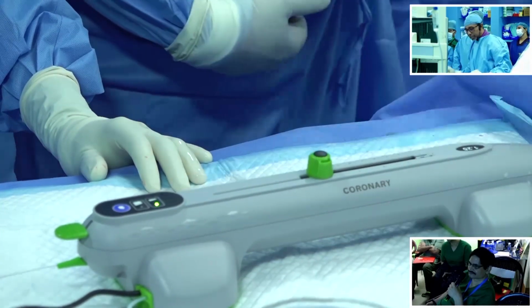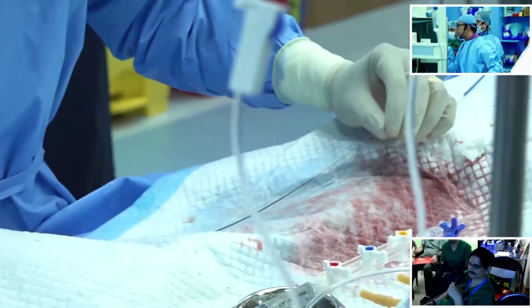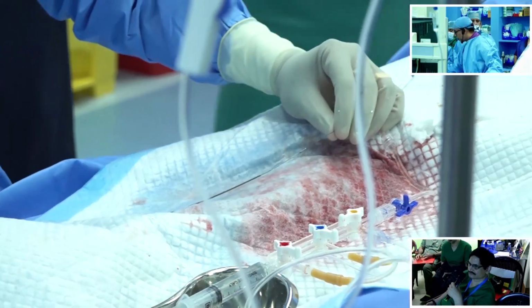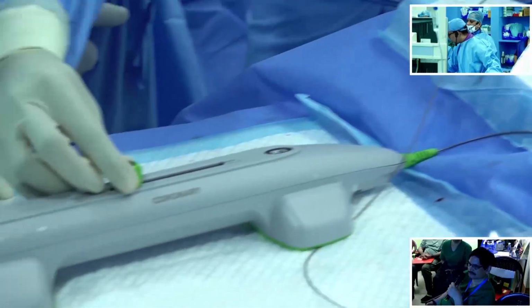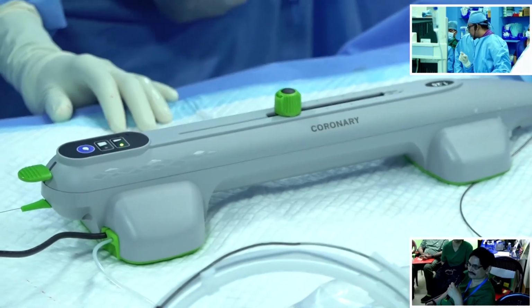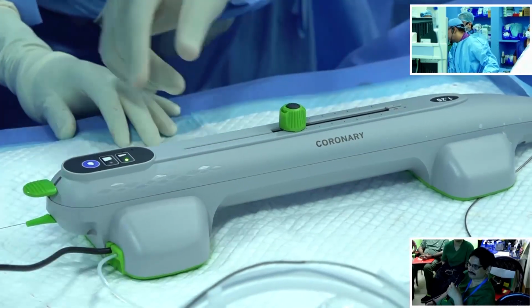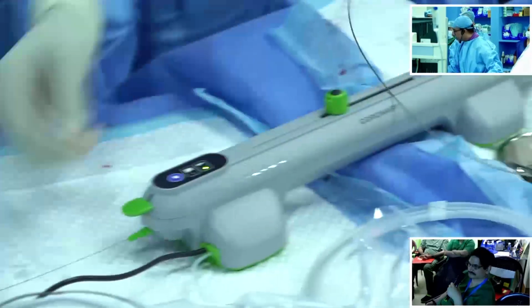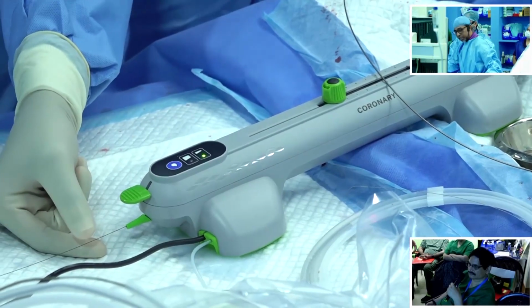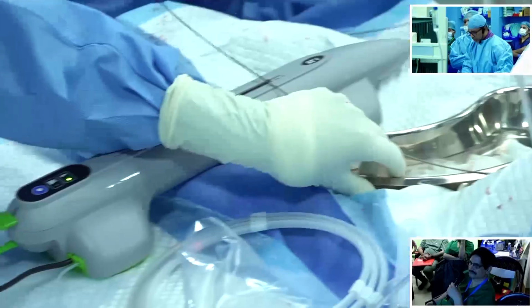So these are the parameters that you need to check before you take the orbital atherectomy catheter inside the coronary artery. We are having reasonably good pressures now. So we keep the advancer knob over here. That's how it's in lock position. Now we get the atherectomy device, the crown, inside the coronary artery. It's a very simple procedure, something similar to rota. One operator can pull it back, and the other operator can push the burr forward, or you can do it with one operator also. That too is possible with this.